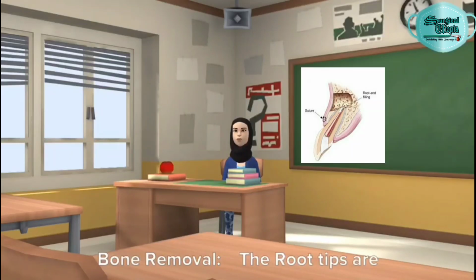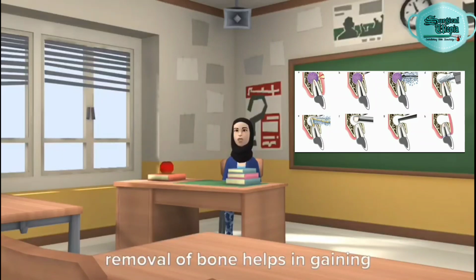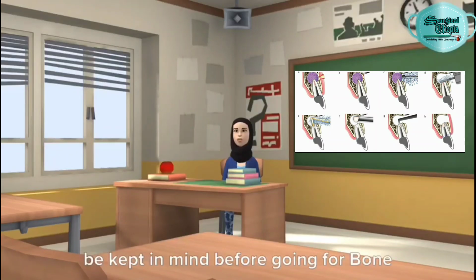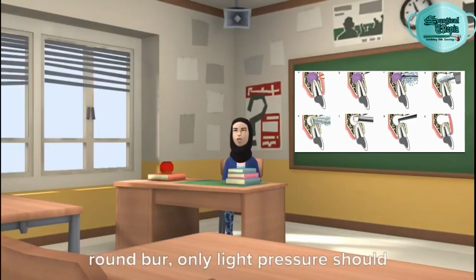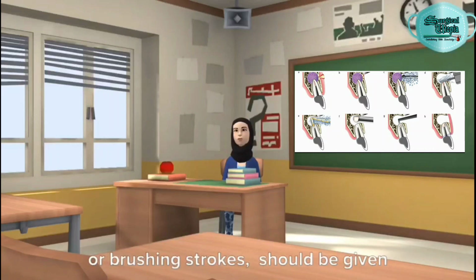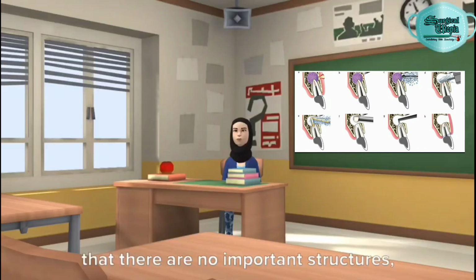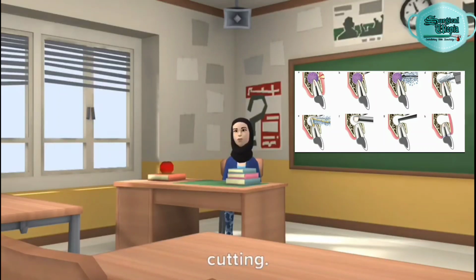Bone removal. The root tips are covered by bone. On the buccal surface, removal of bone helps in gaining access to the periradicular area of the tooth. There are certain tips which should be kept in mind before going for bone removal. Always use a sharp and sterile round burr. Only light pressure should be given while cutting bone. Shaving or brushing strokes should be given while cutting the bone. Make sure that there are no important structures which are being harmed while bone cutting.